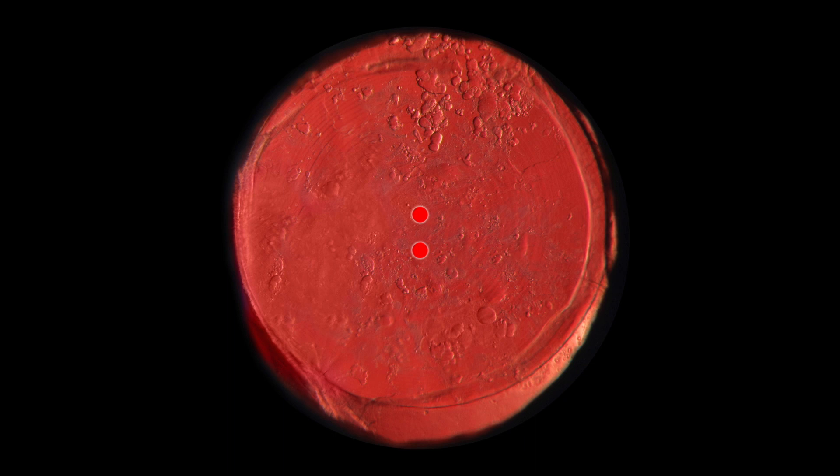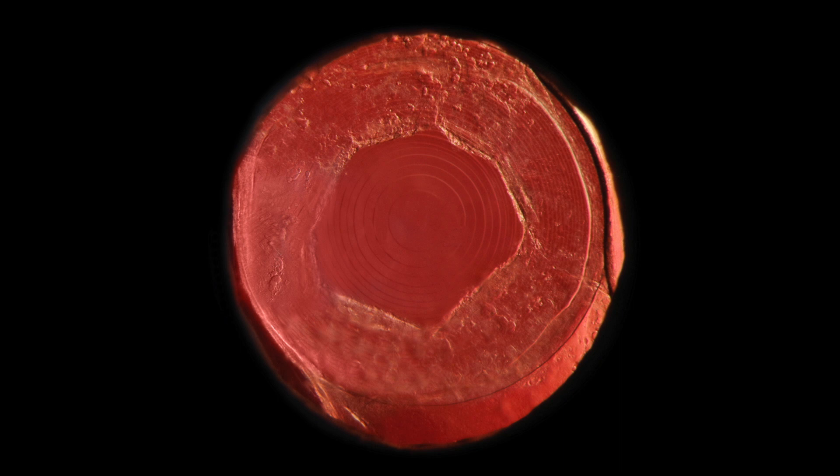An energy level of 2 millijoules should be enough to create an initial opening, and after a few shots we see this intermediate result.